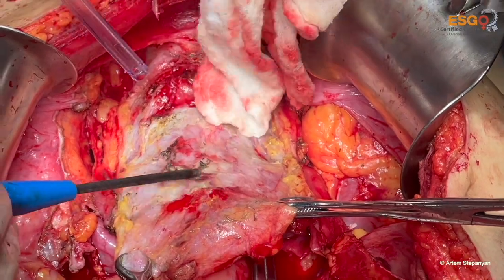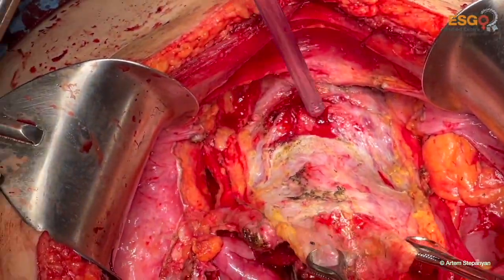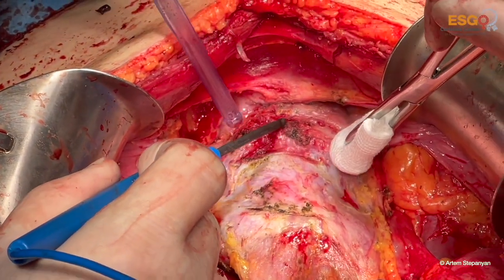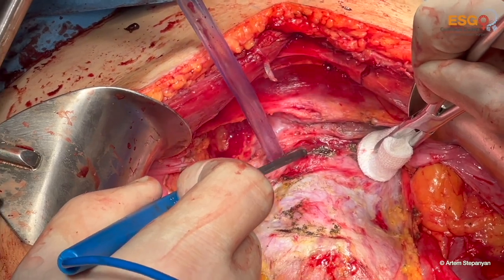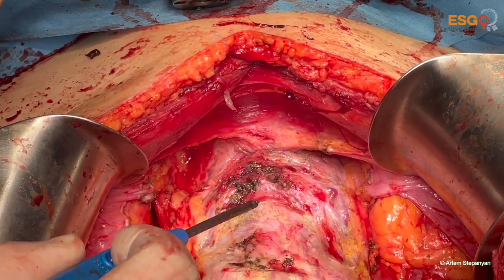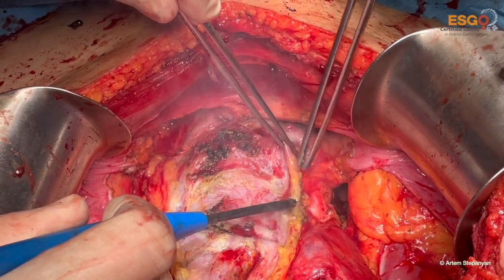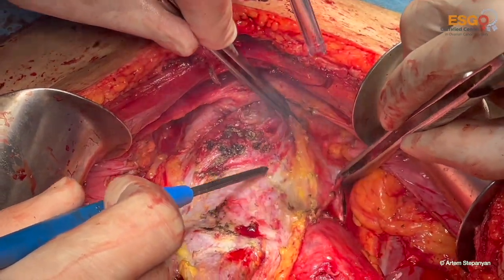Oh, you see the bladder peritoneum in the forceps. In contrast to the ureters, the bladder detrusor is not so sensitive to thermal damage, so it's safe to perform the superficial coagulation on it.